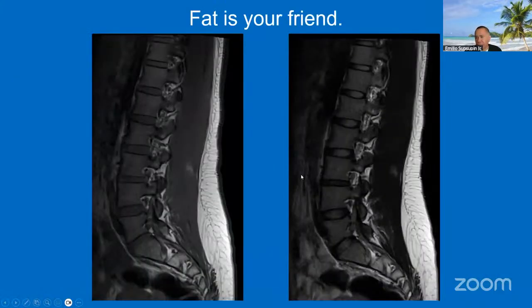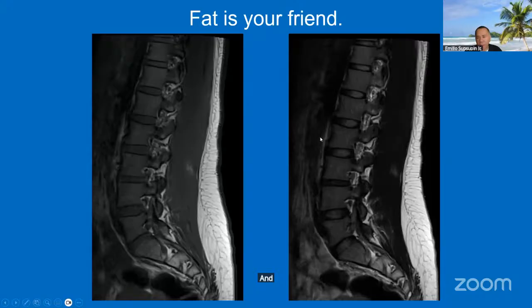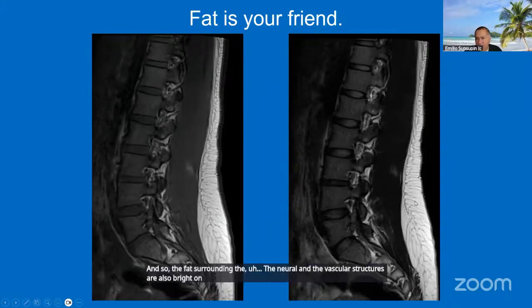Fat is your friend. Basically, we look at the lumbar neural foramina on sagittal or parasagittal images. And you can see here that on T1, this is the signal of your subcutaneous fat. And so the fat surrounding the neural and the vascular structures is also bright on T1, and also bright on T2.